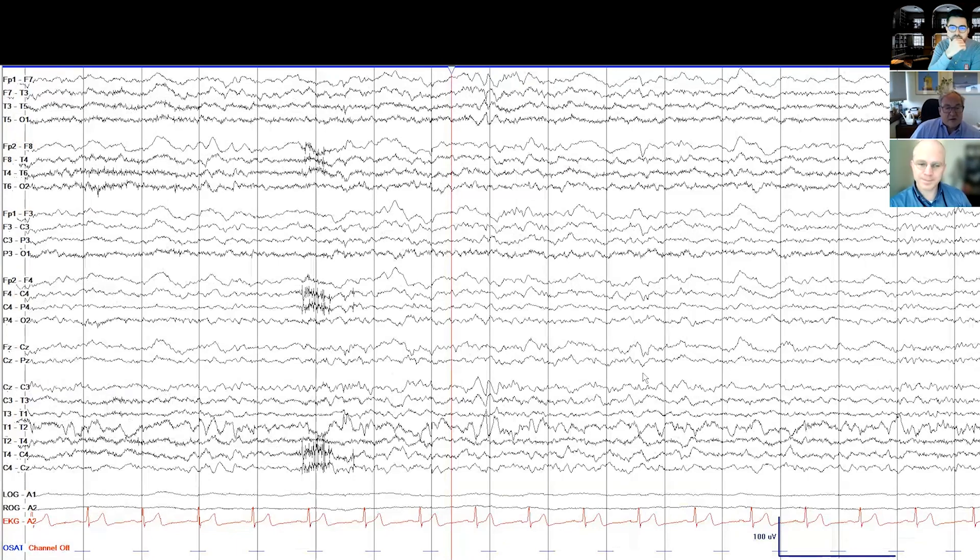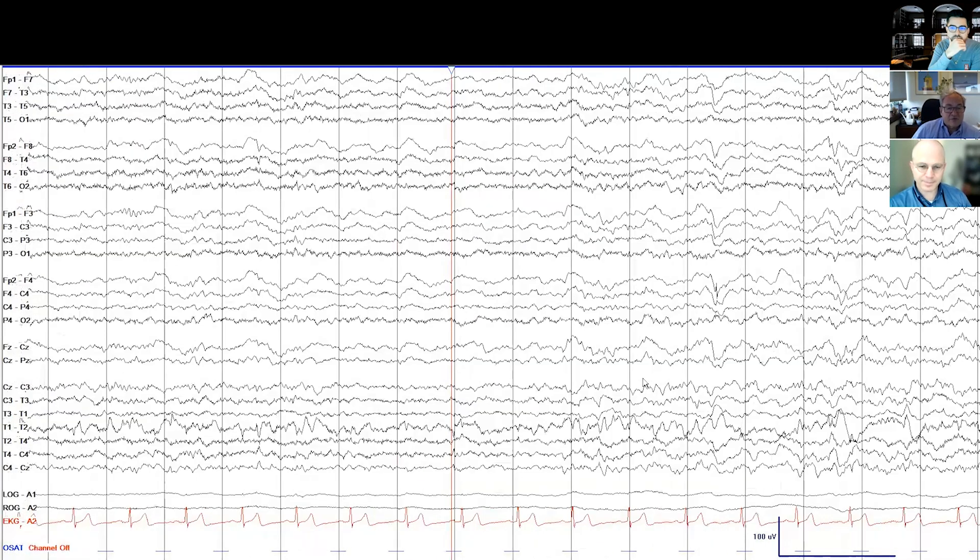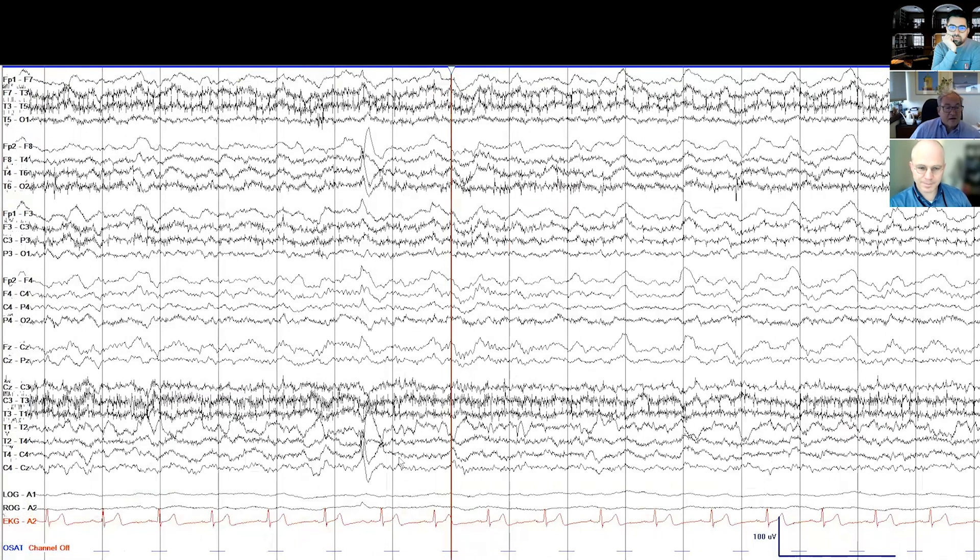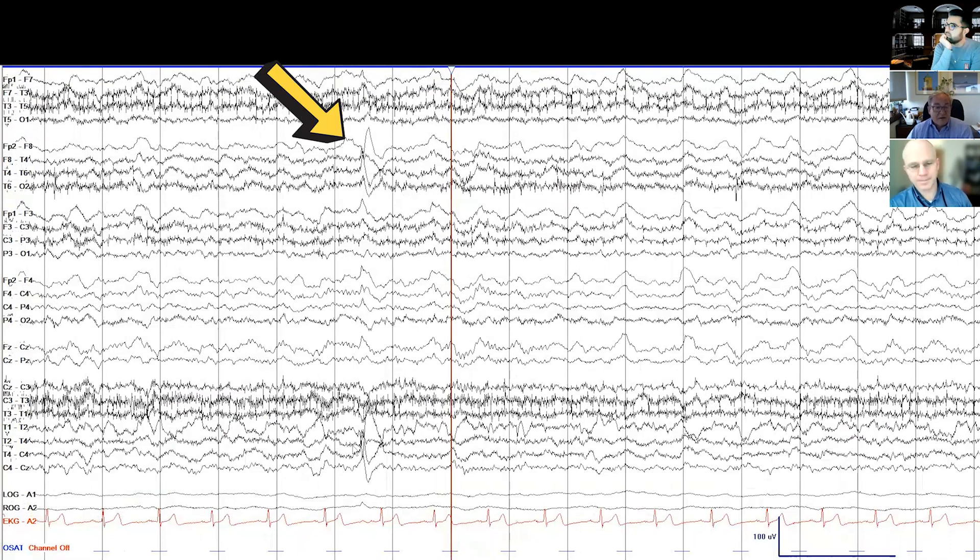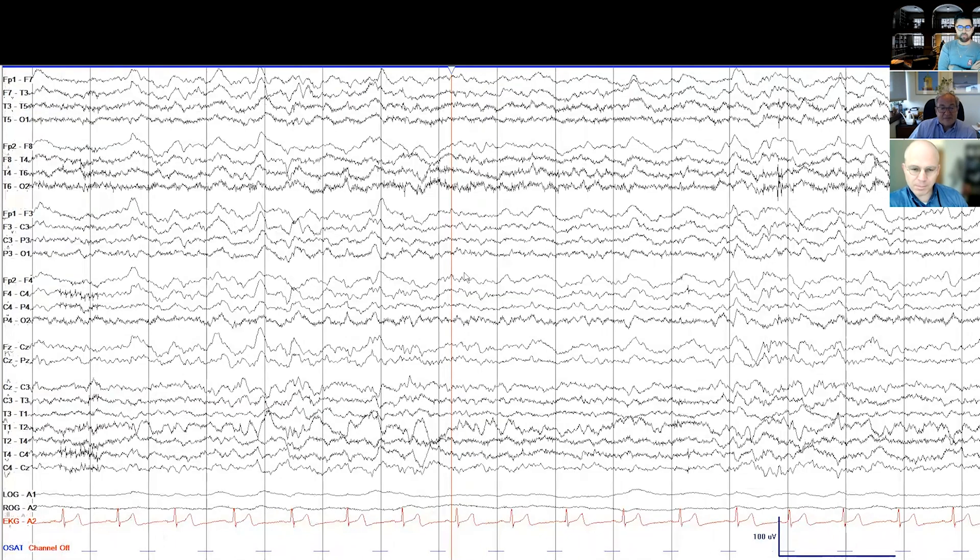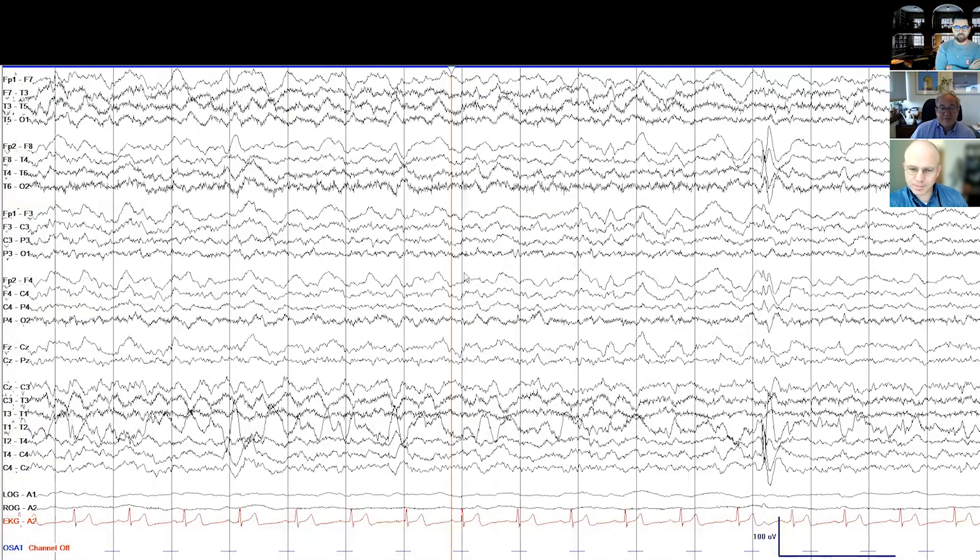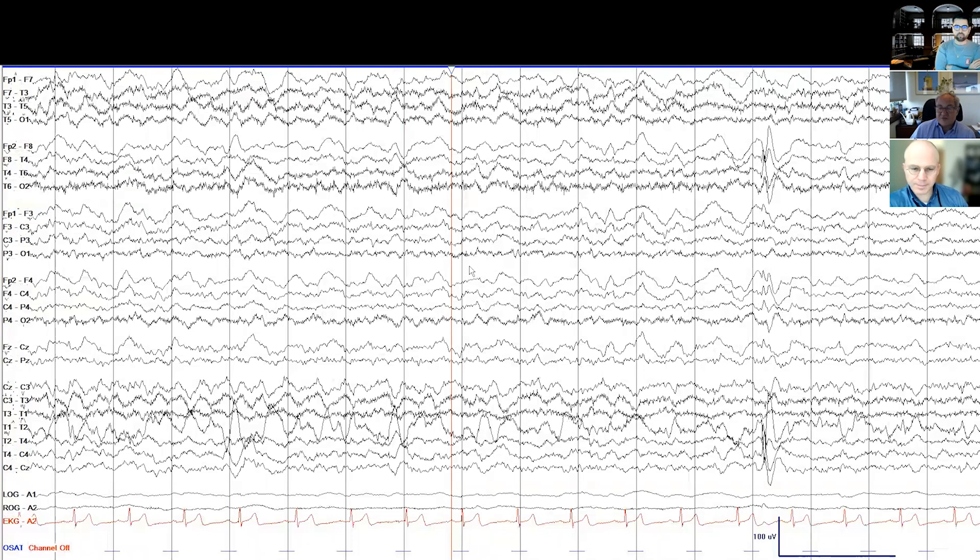So you might think, oh well, he's got left-sided epilepsy. But as we move through this EEG, whoa, he also has some on the right and they're just as sharp and just as juicy, maybe juicier. He may have a slight predominance or even a significant predominance of right-sided abnormalities, but he has enough left-sided abnormalities to make it ambiguous as to whether his seizures all come from one side or the other. Looks like they're all temporal though.